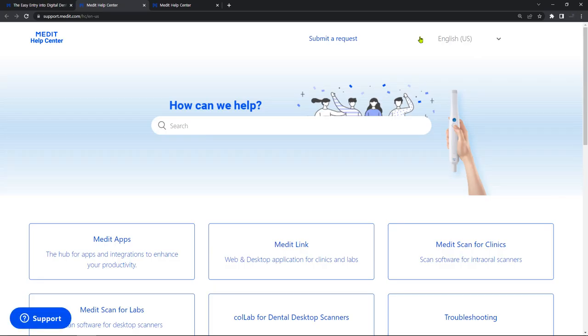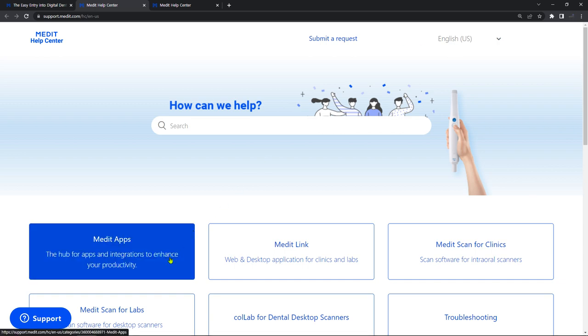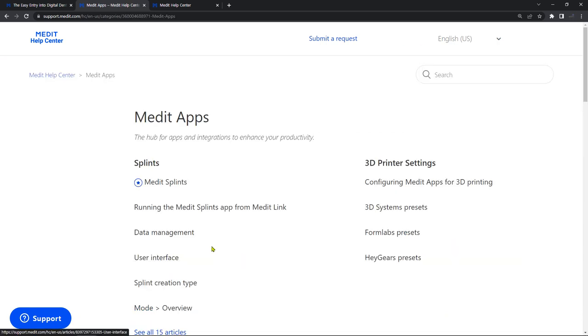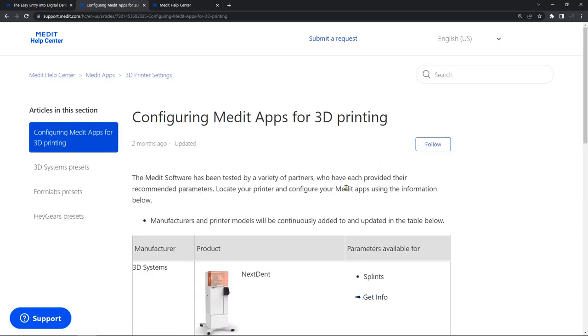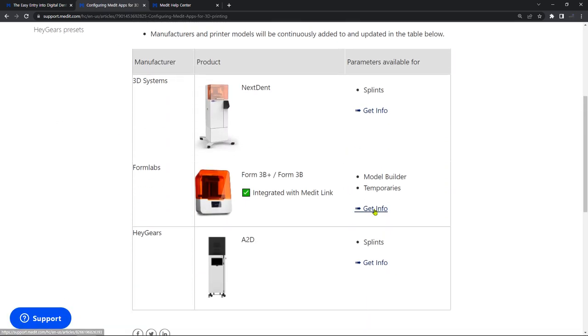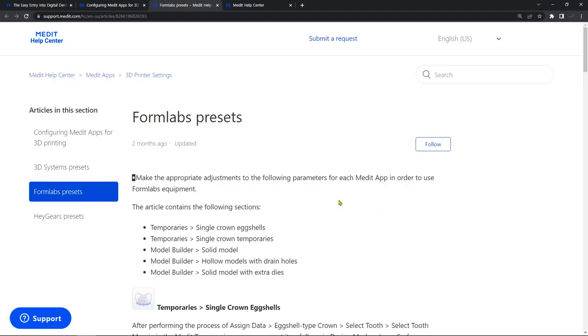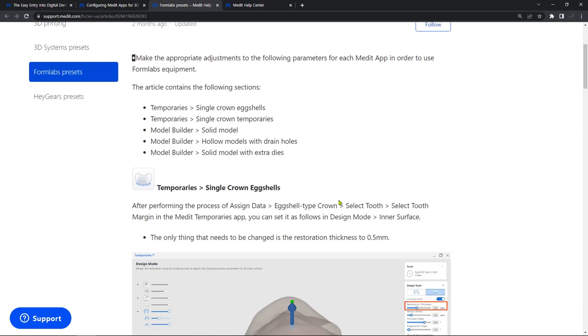To have the best result when printing with your specific 3D printer, check out our partners' recommended parameters in Medit Help Center.